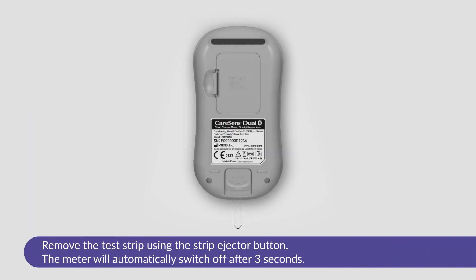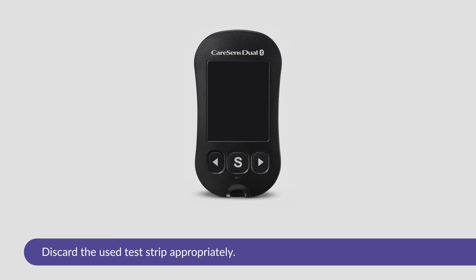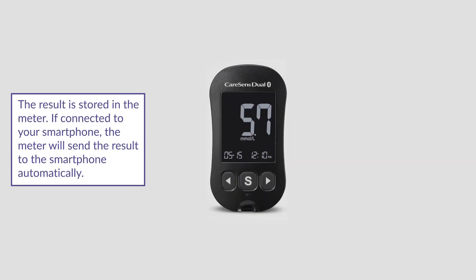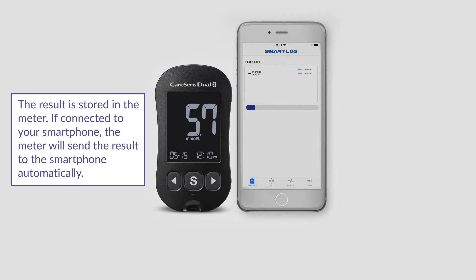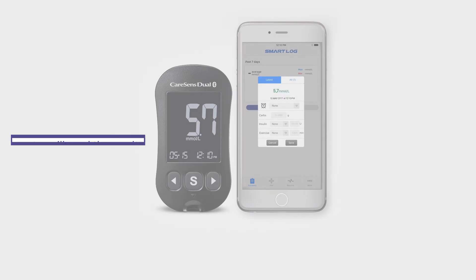Remove the test strip using the strip ejector button and the meter will automatically switch off after three seconds. Discard the used test strip appropriately. When you remove the test strip, the result will be stored in the meter, and if connected to your smartphone, the meter will send the result to your smartphone automatically.